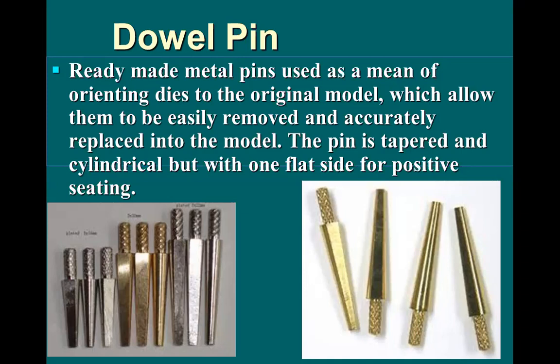Its design, as you see in these pictures, is a taper.